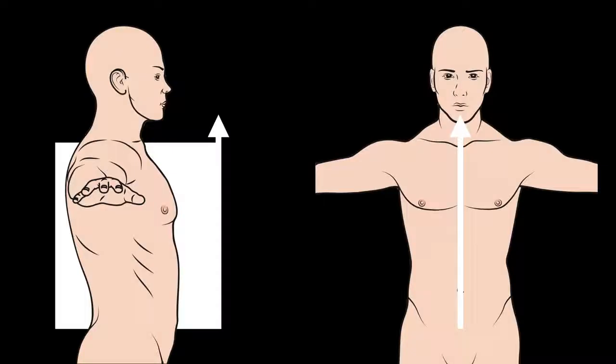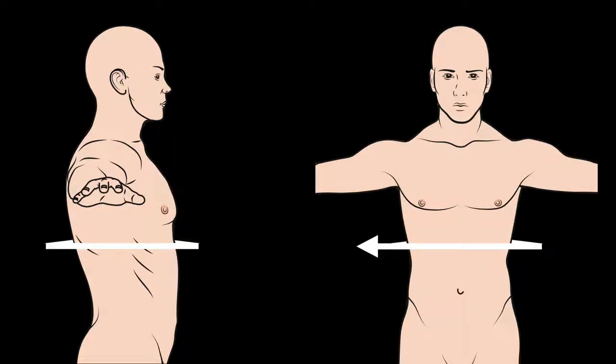When we do the scan, you want to be on an abdominal preset. This will help your imaging quality. It will also mean your indicator will be pointed towards the patient's right or their head. In a sagittal plane, the indicator will be pointed towards the patient's head, and you can see there the indicator is pointed towards the patient's head. In a transverse plane, your indicator will be pointed towards the patient's right side.